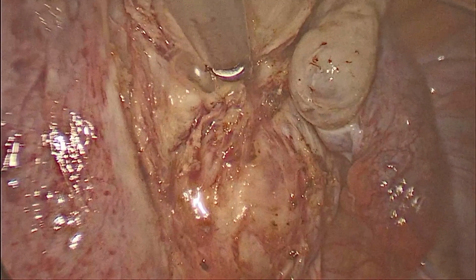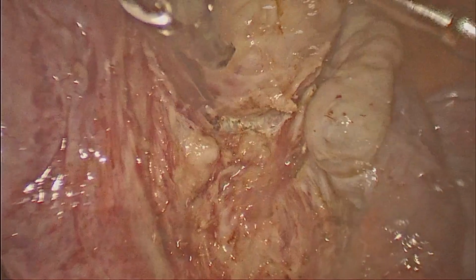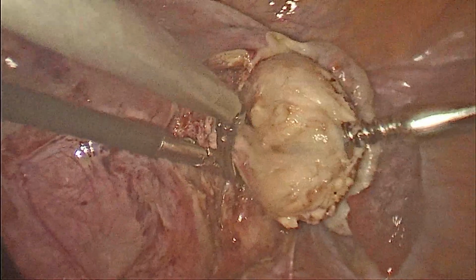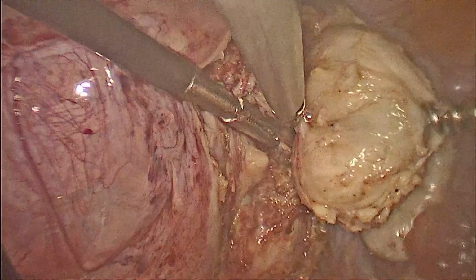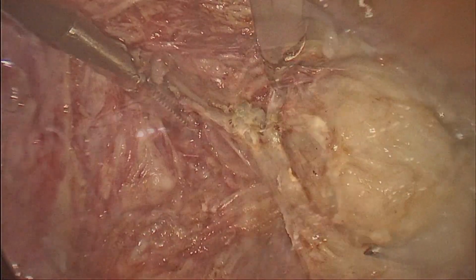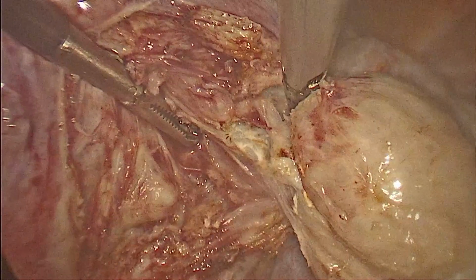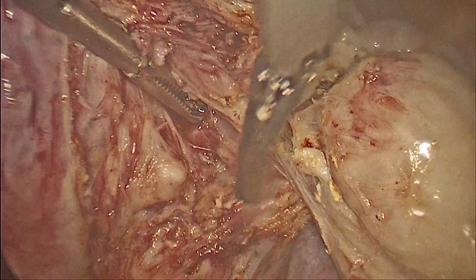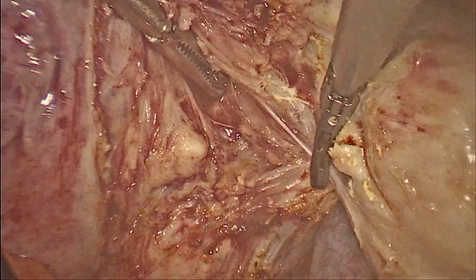Even though the fibroid is coming out easily, it should not be peeled off in a quick way, to prevent bleeding. It should be easily dissected out of its bed, and all the myometrial fibers adhered to the myoma are dissected out, and then enucleation of the fibroid is done.